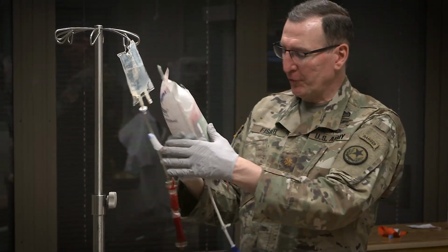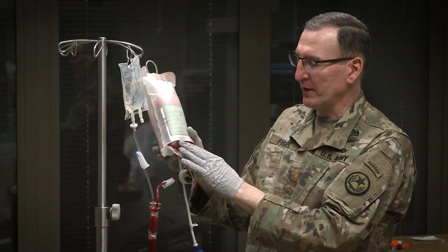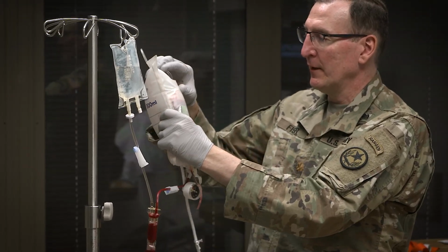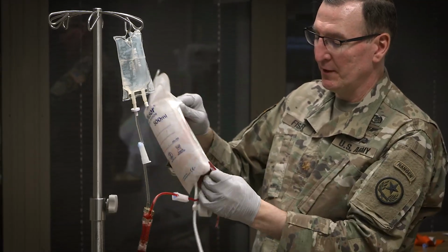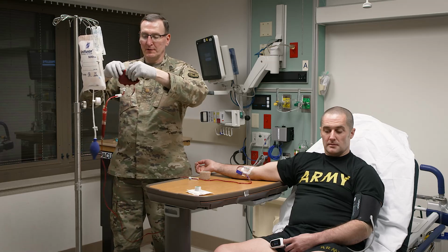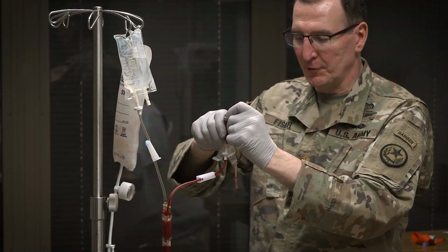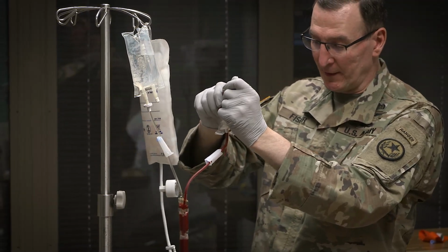All right, we're almost done with our transfusion. Some rapid infusers do kind of lose the bottom portion of this blood. So when that happens, I go ahead and I just take it out. And I'm just going to squeeze it manually to make sure my patient gets as much blood as I can give, because clearly it's indicated, and blood is a very, very scarce resource on the battlefield, and so it's important that we try to use all the blood in the blood bag as we can.